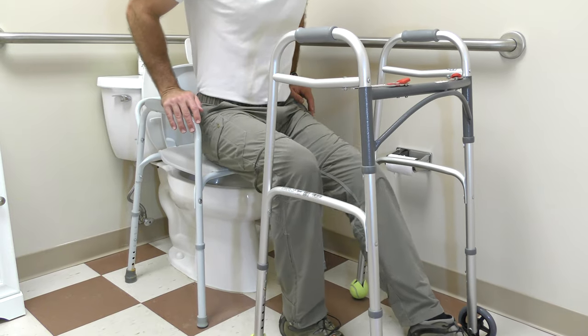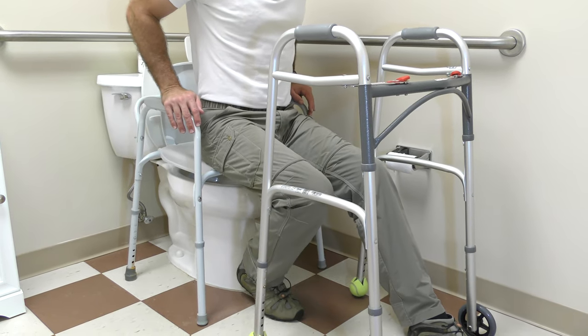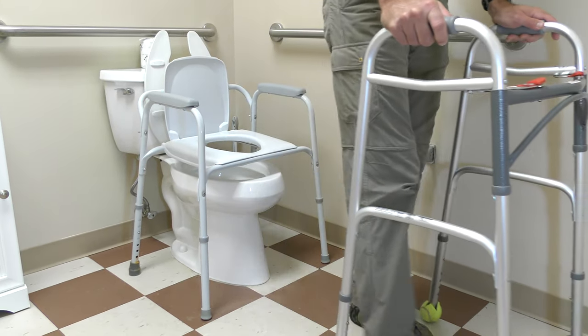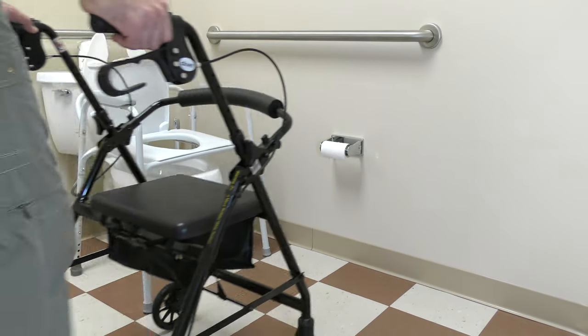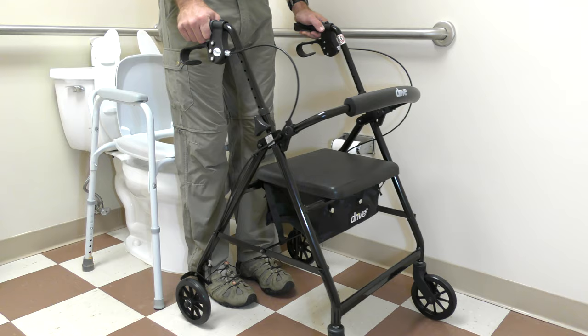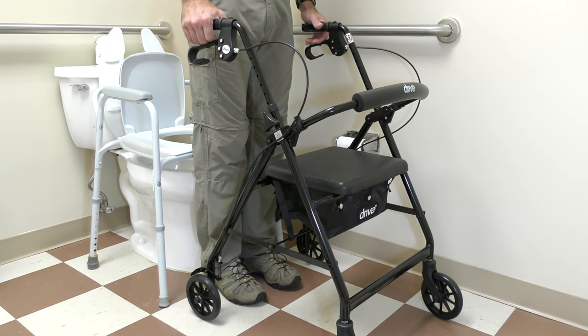To stand, reverse the process. Here it is again, but this time using a four-wheeled walker. Note that toilet chairs with armrests make this task much easier.